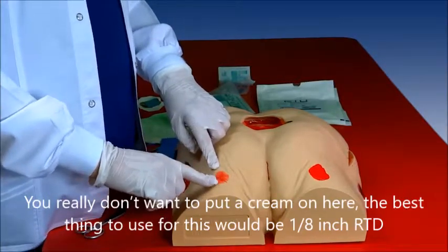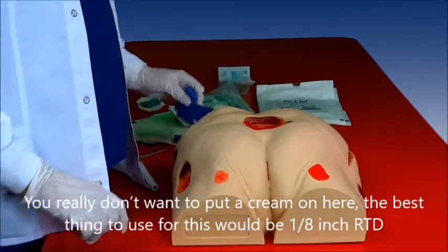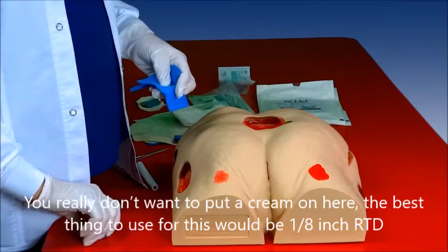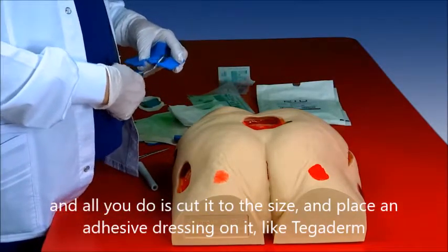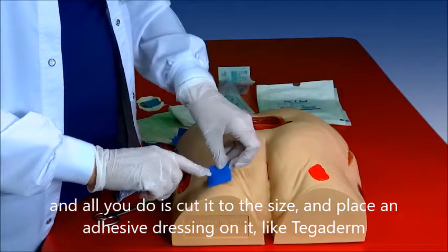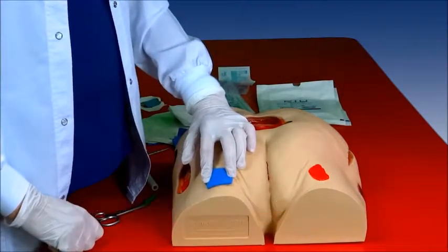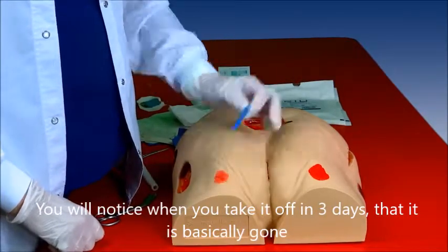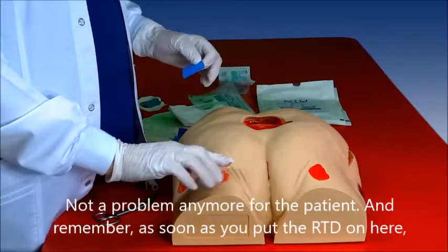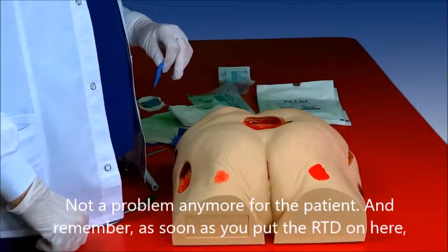You really wouldn't want to put a cream on here. The best thing to use for this would be one-eighth inch RTD. All you do is cut it to the size and place an adhesive dressing on it like the Tegaderm. You will notice when you go to take it off in three days that it's basically gone and it's not a problem anymore for the patient.